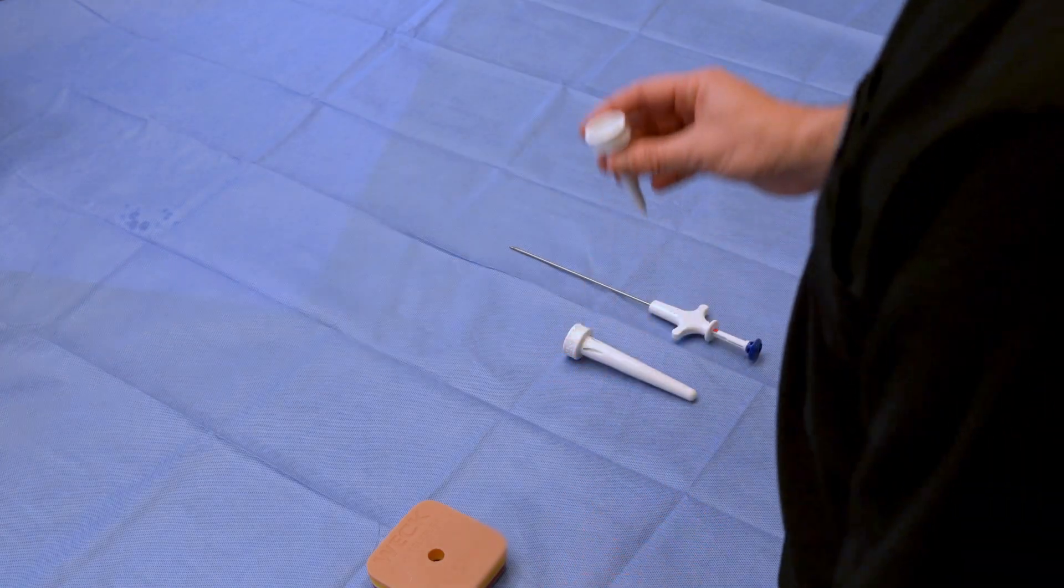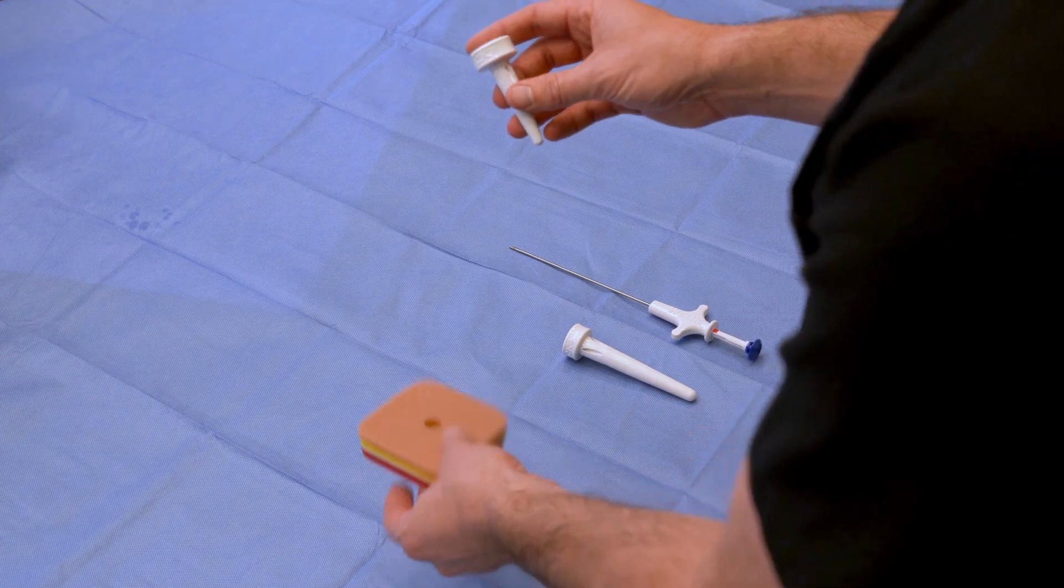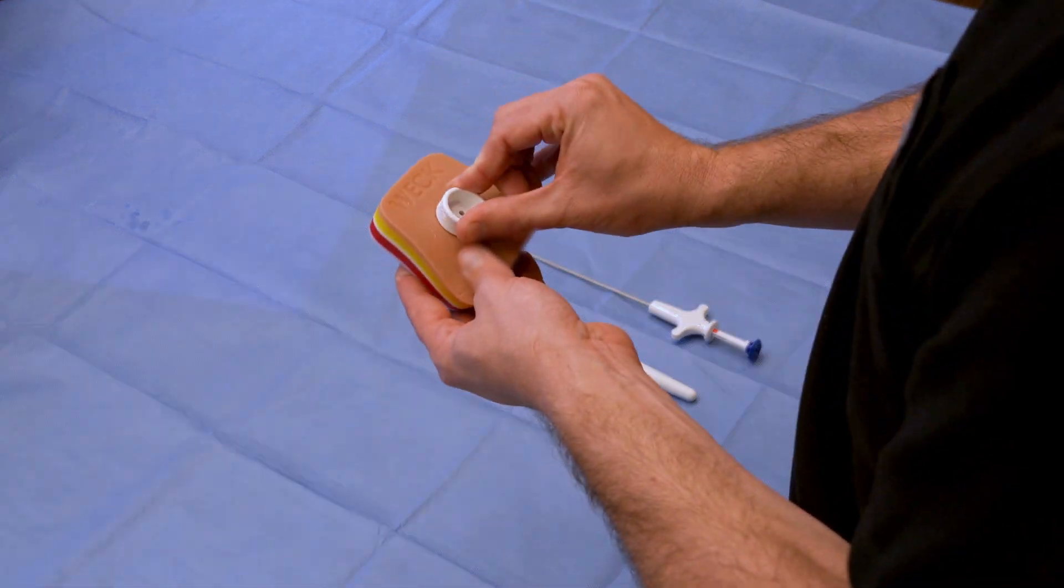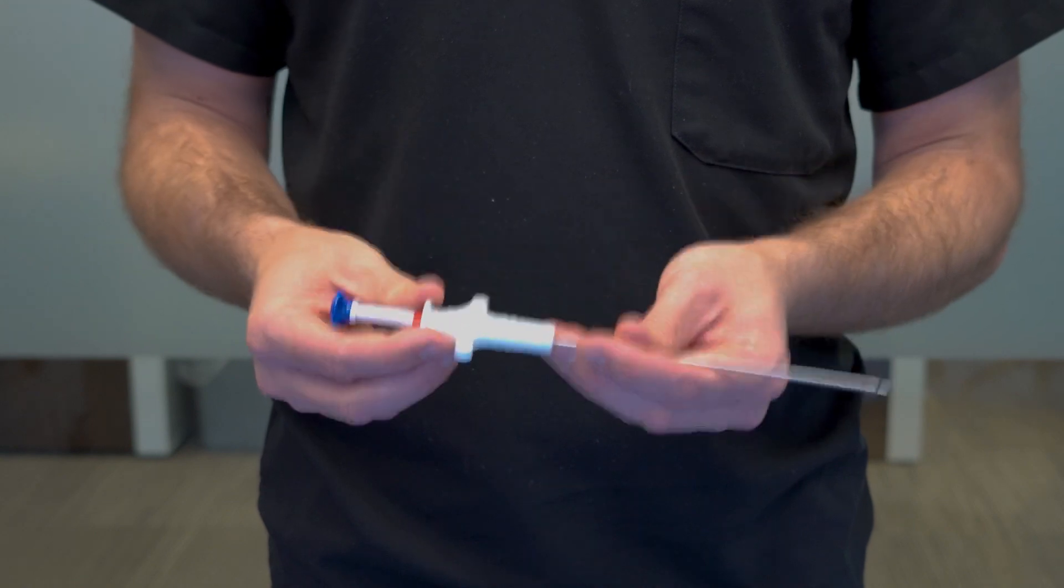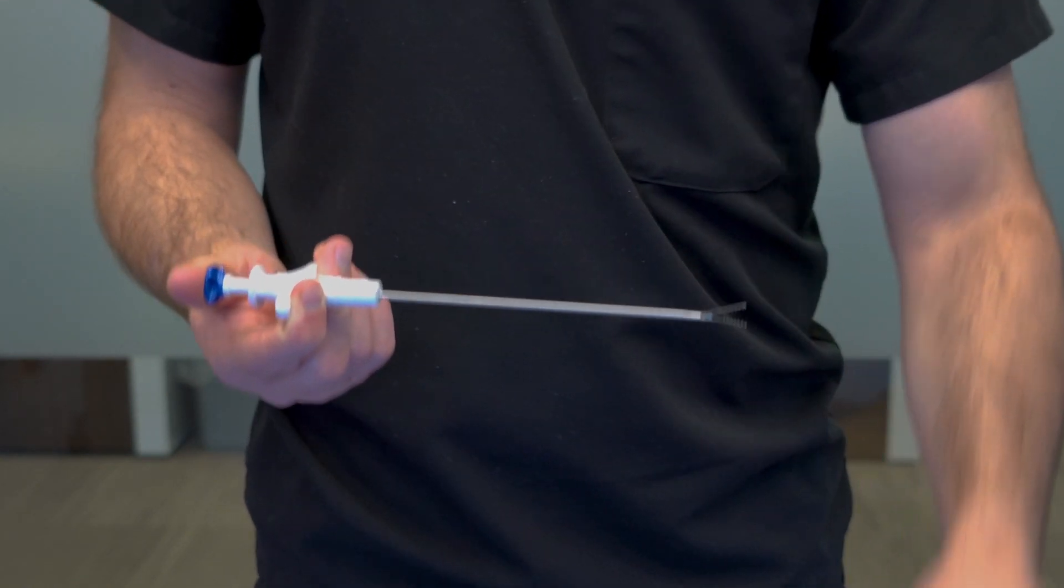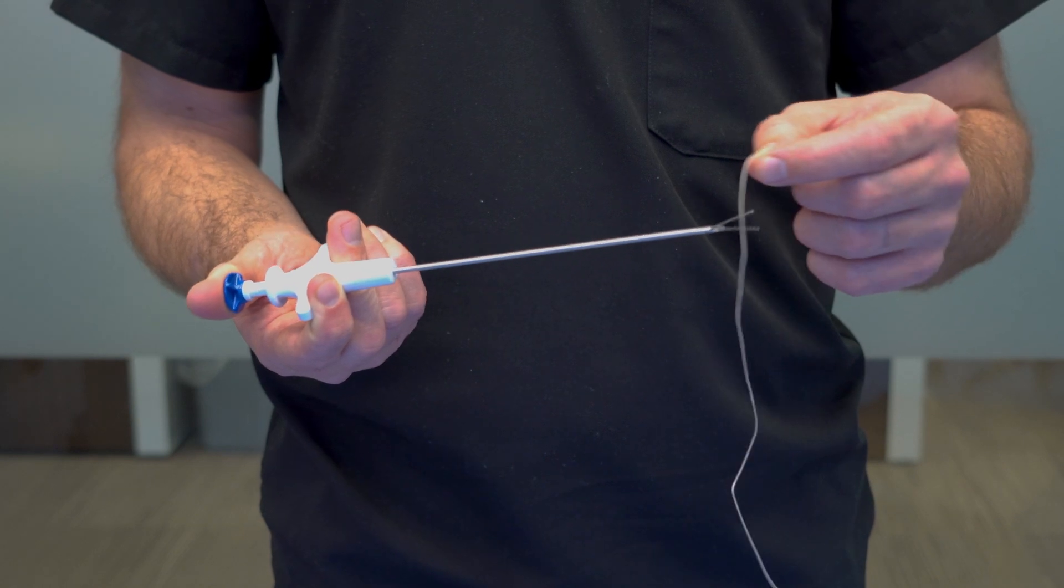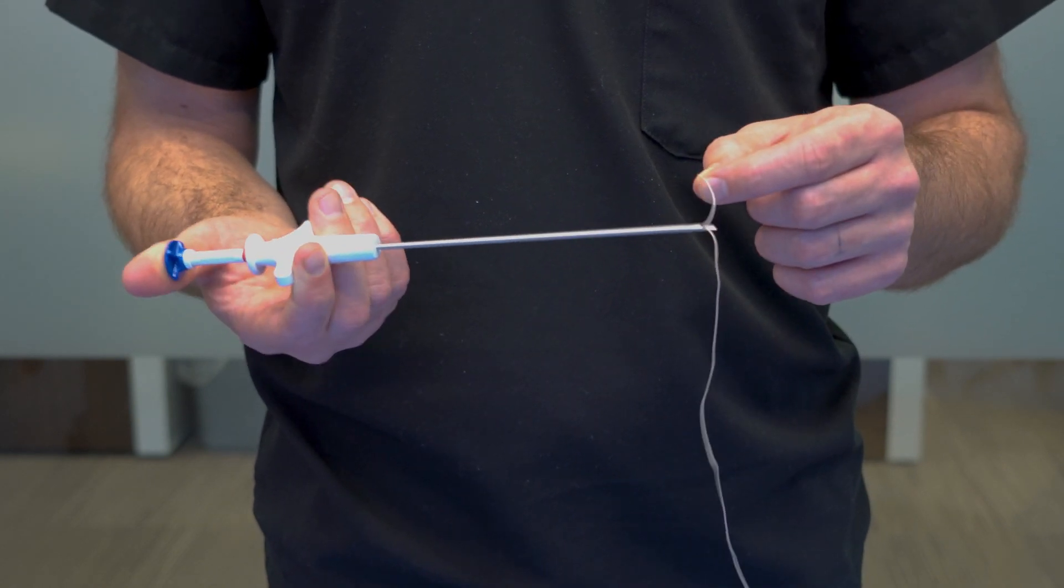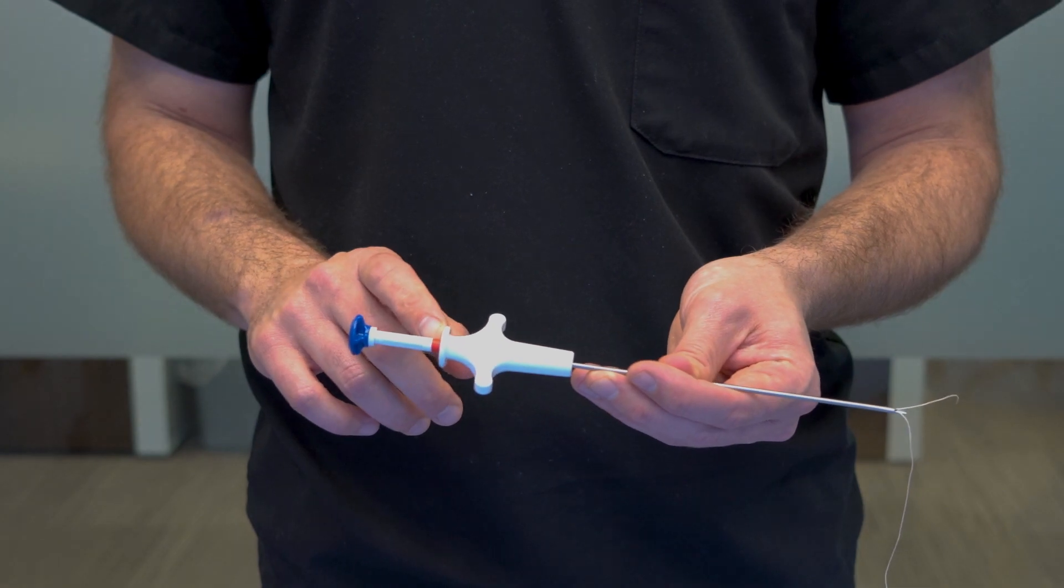Place the appropriately sized pilot guide in the fascial defect. Open the jaws by pressing the button. Place the suture in the jaws. Close the jaws by releasing the button. Ensure the red band is showing.